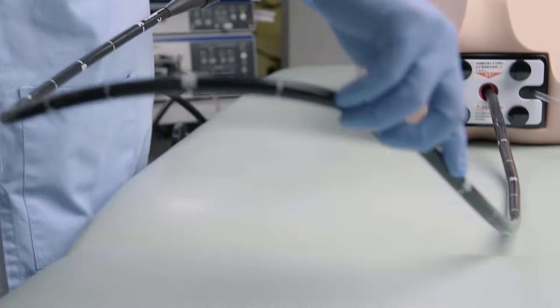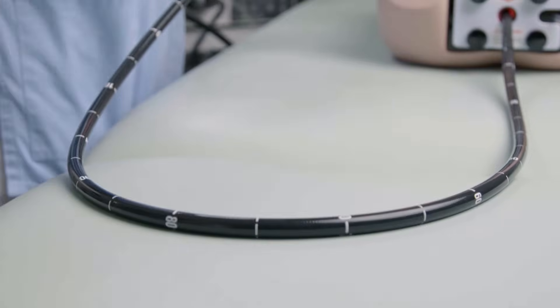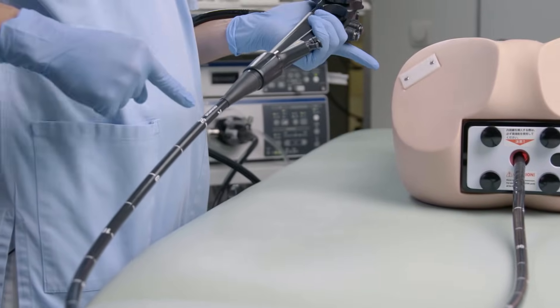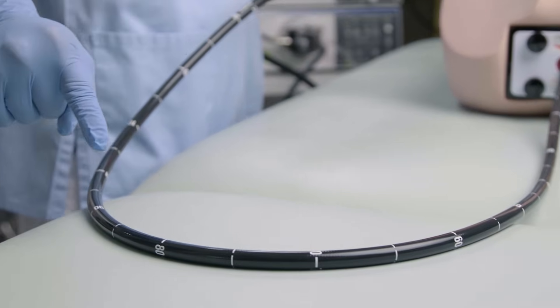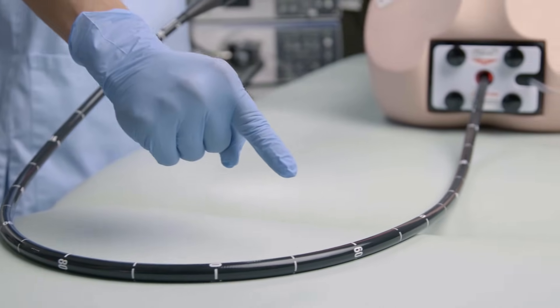In order to control the colonoscope properly, make sure that the long insertion tube always lies on the table and not hanging down.